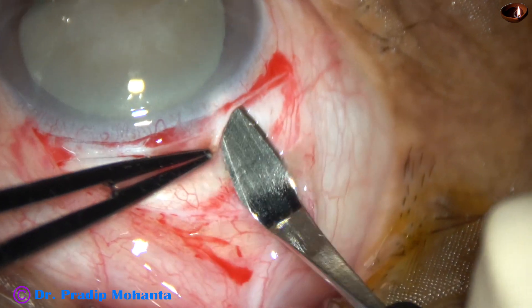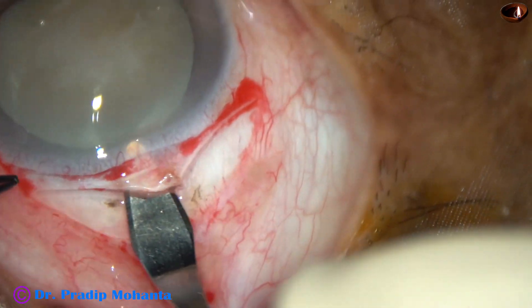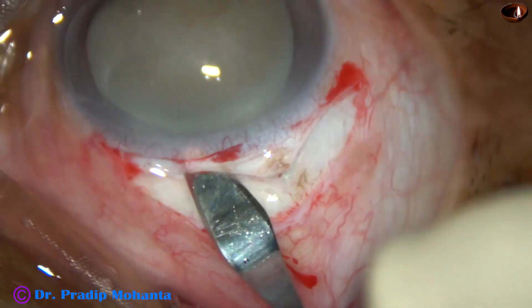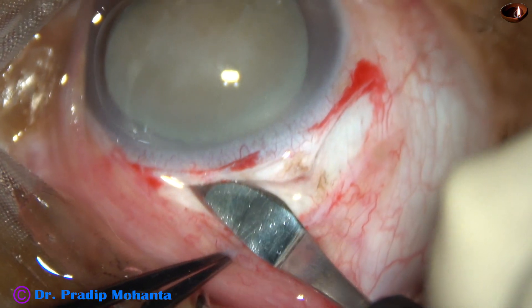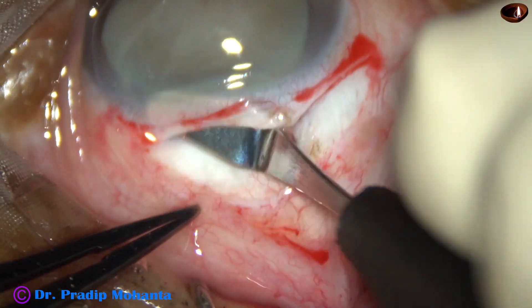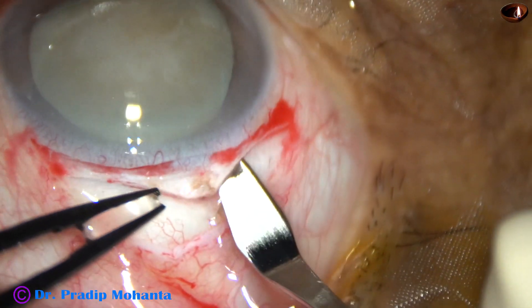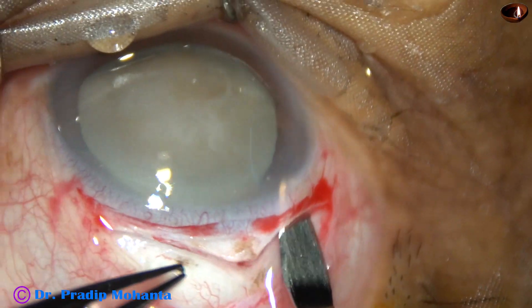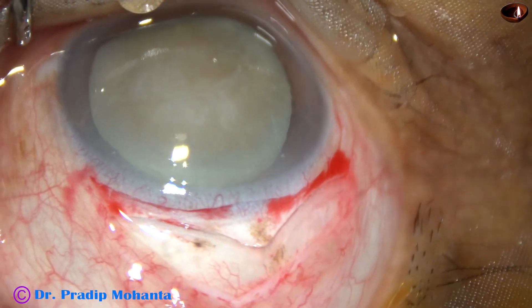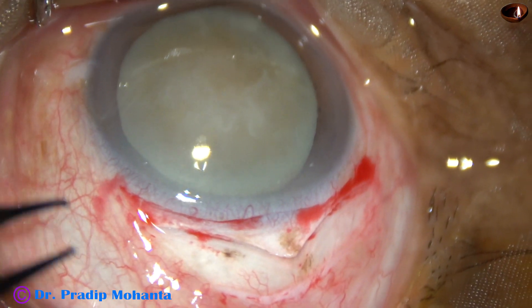Just making the sclerocorneal tunnel just like we make in SICS. Go into clear cornea for about 1.5 mm, and sweep — in this case backward and to the left — and make the sclerocorneal tunnel. Since 2 SICS wounds are adjacent to each other, it has taken the shape of a large V-shaped incision. The sclerocorneal tunnel to the right side is now being made. The size of this incision is about 10 mm.